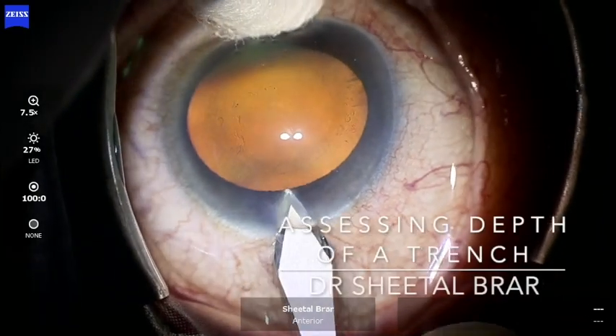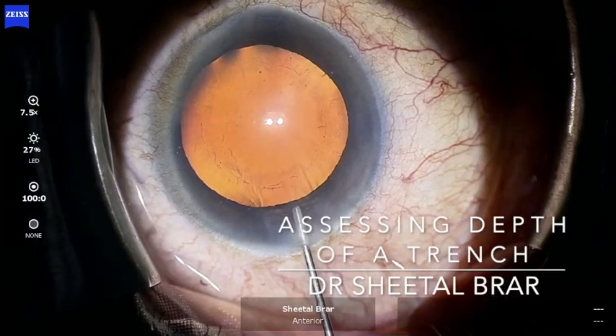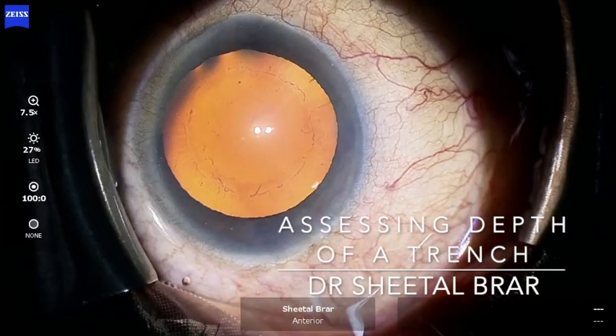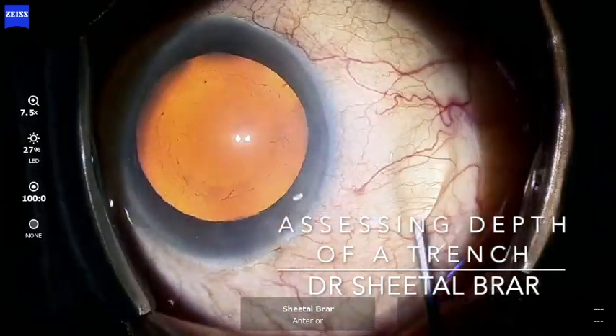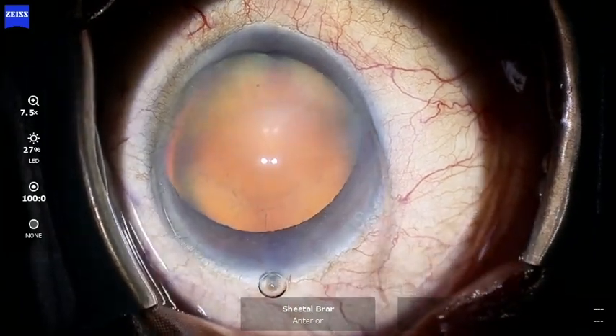Friends, through this video I wish to address a common question asked by residents as to what is the adequate depth of a trench while performing a stop-and-chop or divide-and-conquer technique.